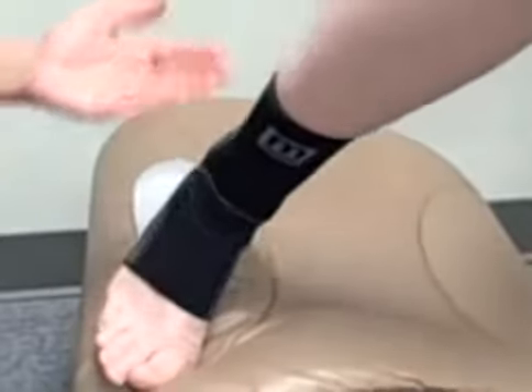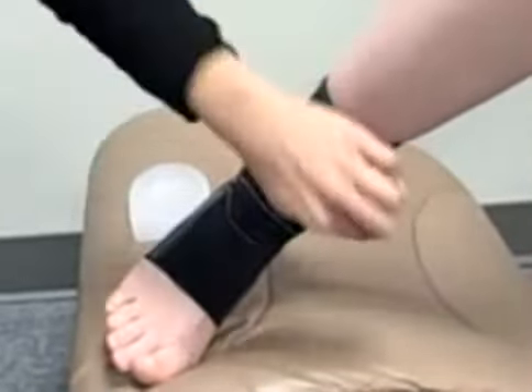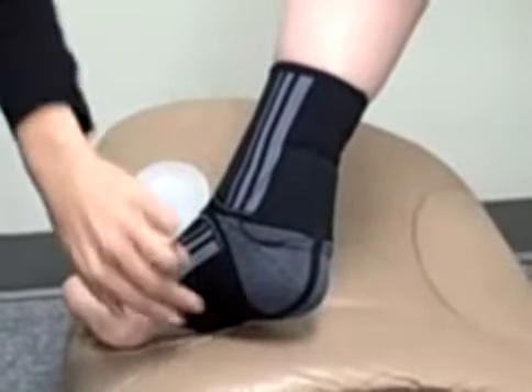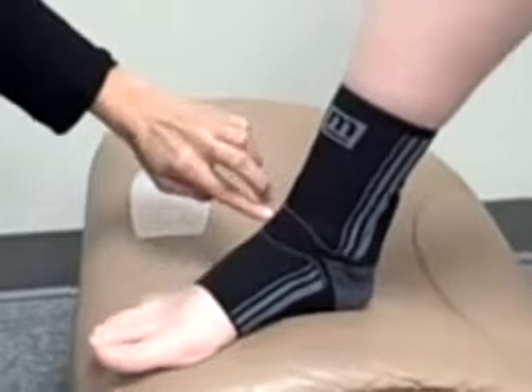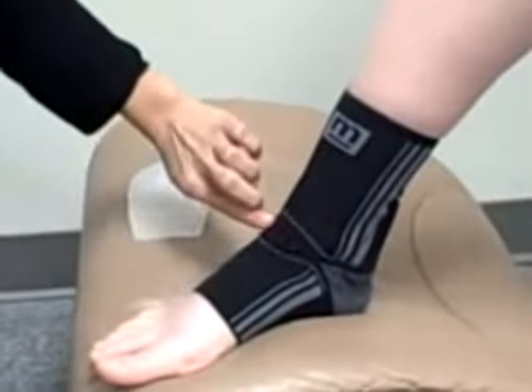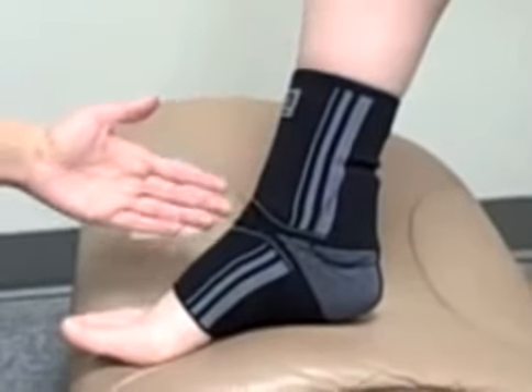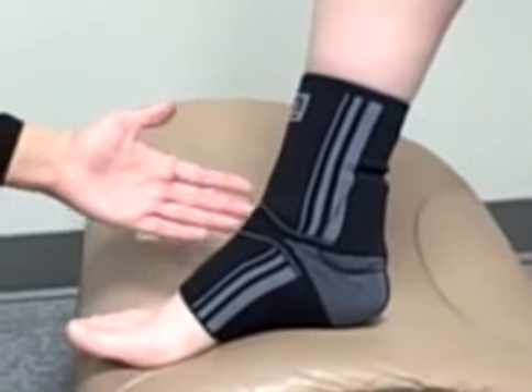It is a knitted material with a simple elastic seam going down the back of the foot. On top of the foot, there is a knitting difference here and here to provide a breathable anatomical fit and to avoid any bunching that may occur.